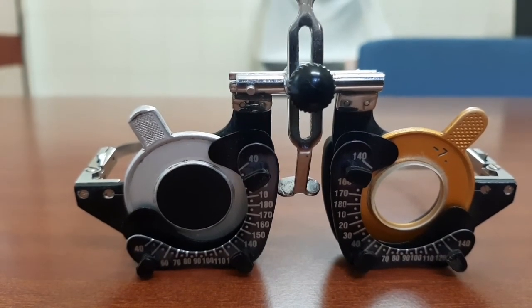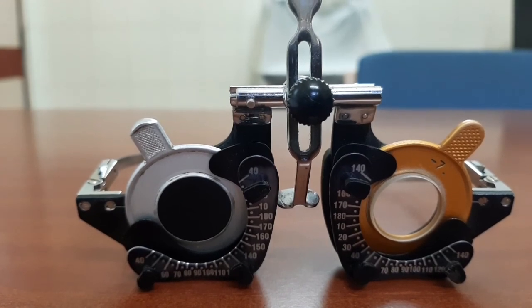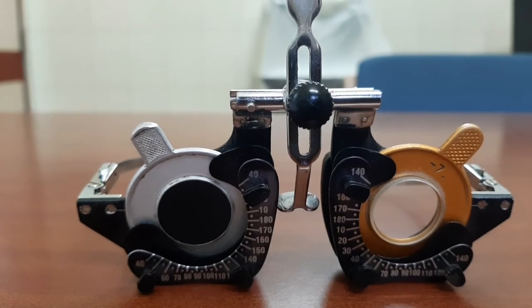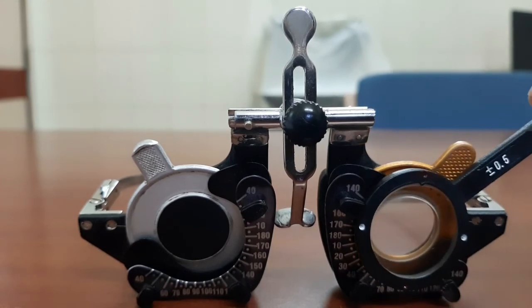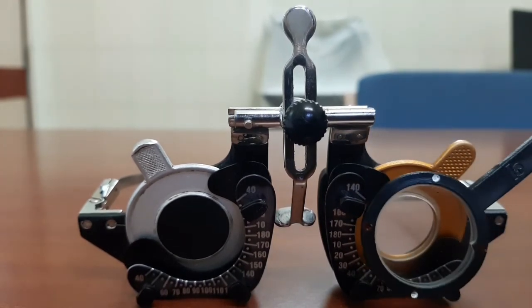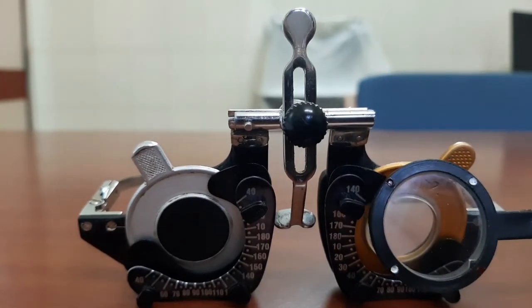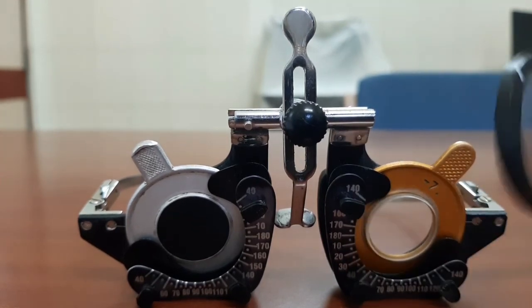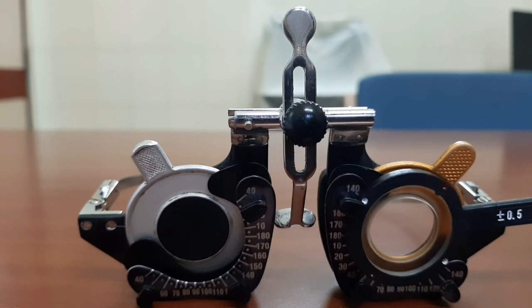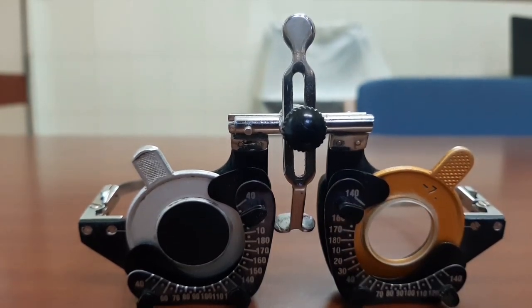The second indication for Jackson's cross cylinder is to confirm whether the patient needs cylindrical power or not. Give the spherical correction needed — or even without any spherical correction — and place the Jackson's cross cylinder at 180 degrees, 90 degrees, as well as at 45 degrees and 135 degrees. If the patient prefers any one of the axes, it indicates the patient needs cylindrical power at that particular axis, and the refraction process is repeated accordingly.